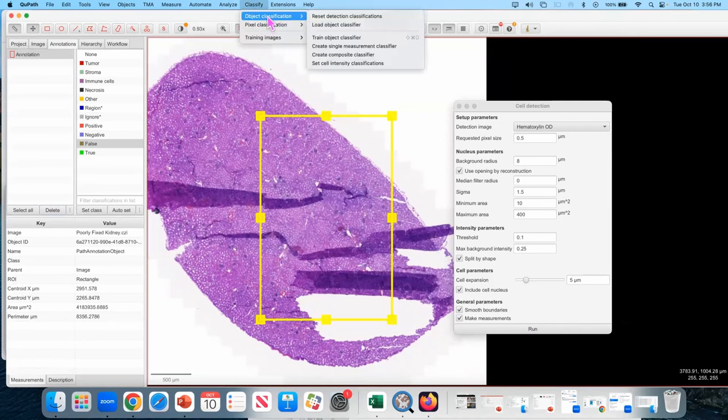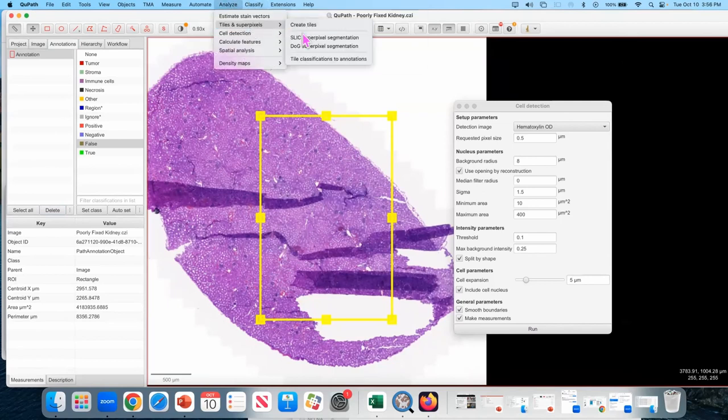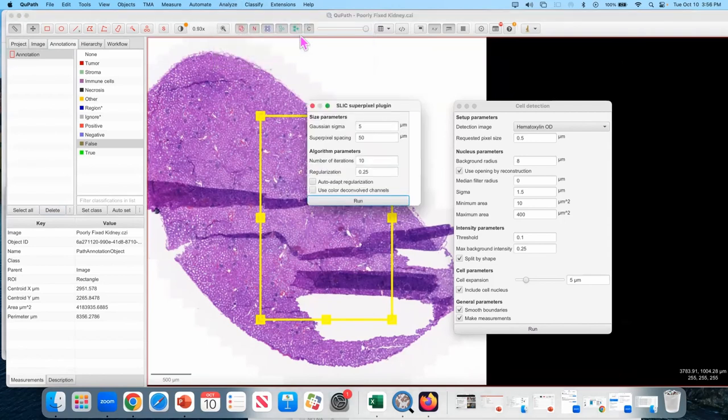Okay. So under Analyze and Superpixels, there's these things called SLIC superpixels. Superpixels are kind of like if you took the wand tool and pointed it at lots of different things. It's a way of grouping the pixels that respects the natural boundaries of the tissue, of whatever it is you're looking at. But they're not really pixel by pixel perfect objects. And so I believe for this one, what I was doing was this.